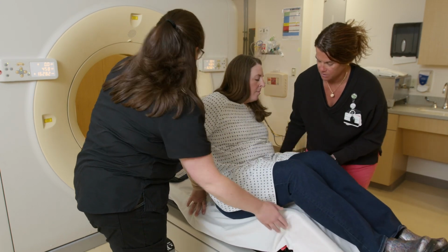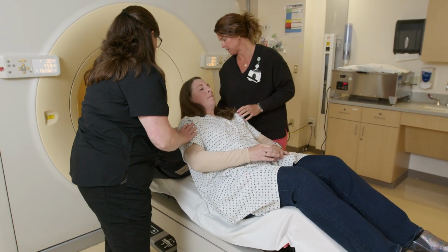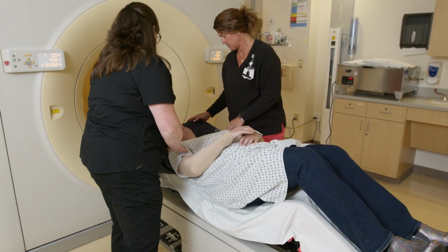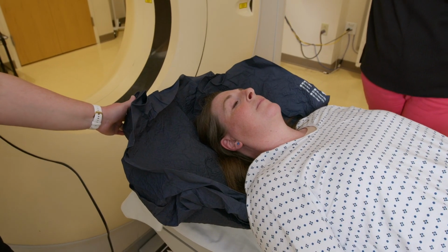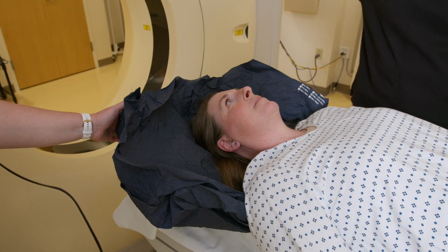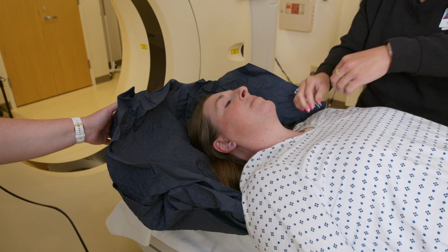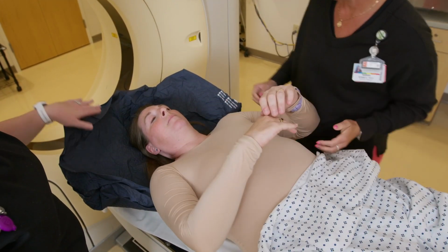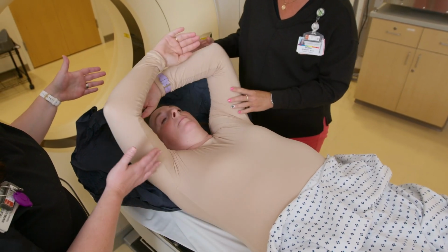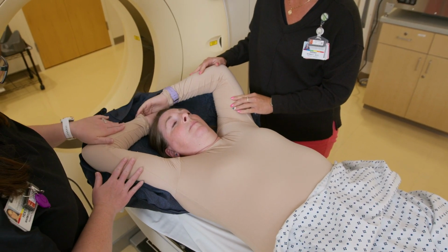We'll ask you to lie on your back on a firm table with a mold under your head and shoulders that will be customized specifically for you. As part of the radiation planning session, as well as radiation treatment, we'll ask you to uncover your chest. We know this experience is unfamiliar and may feel awkward. We go to great lengths to ensure as respectful an experience as possible.